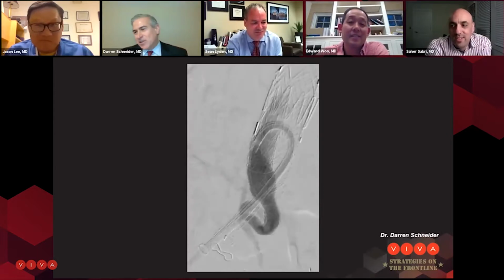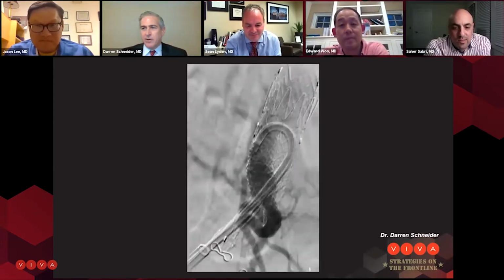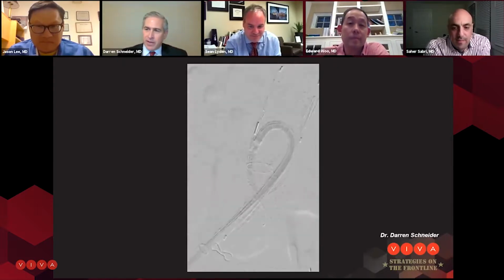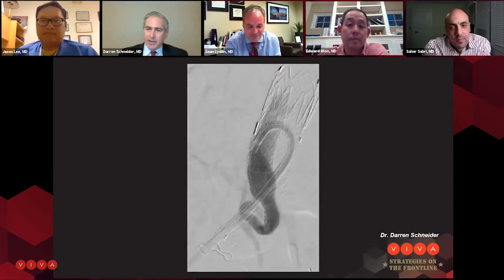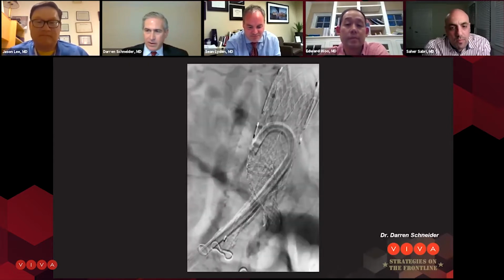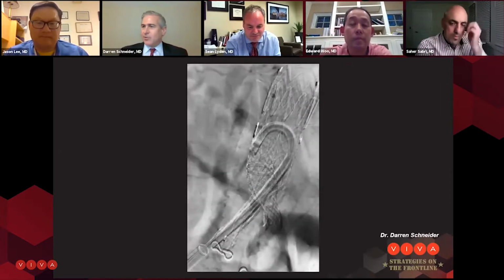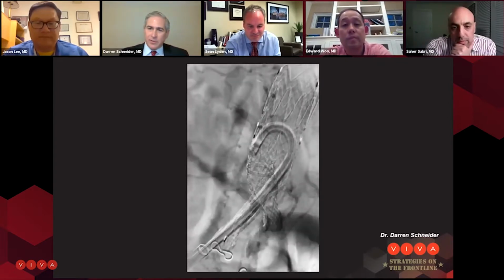Yeah, so it actually works pretty well. My logic, you could say the guy's young and you should consider an open surgical repair, but I think the reality is if you take this repair into healthy vessels down in the external iliacs bilaterally, and those are non-aneurysmal, that I think is going to provide him with a durable result. You can always come back later and do an open conversion. It's not like you're putting all these snorkels into the visceral vessels. You still could convert this if you ever had to.